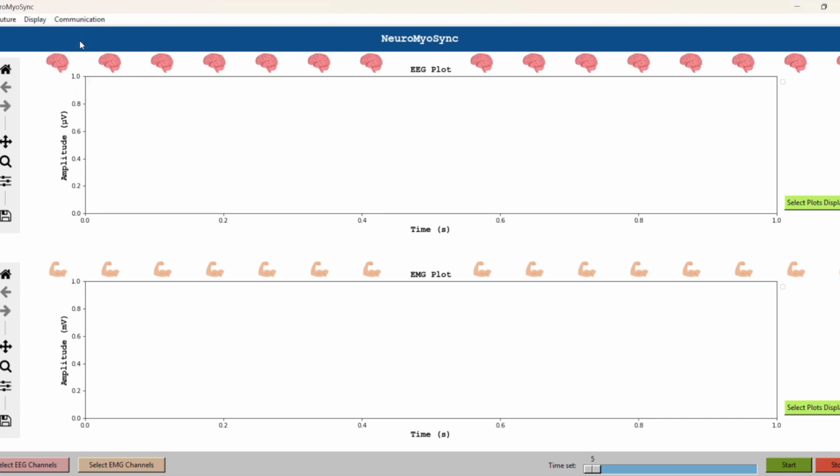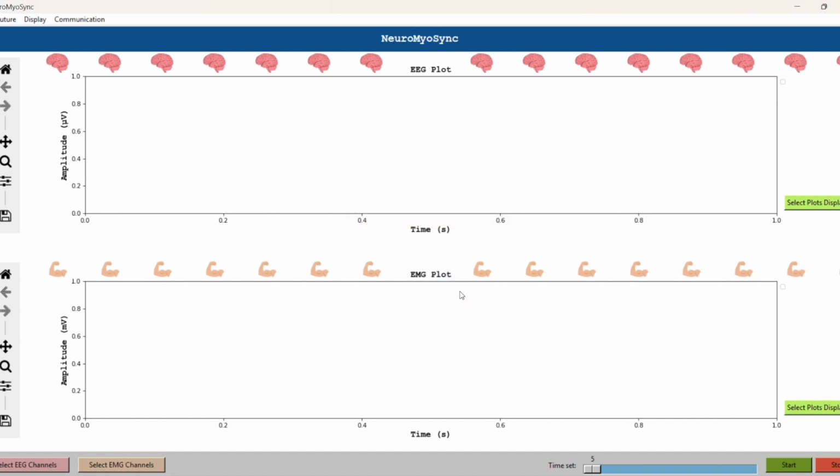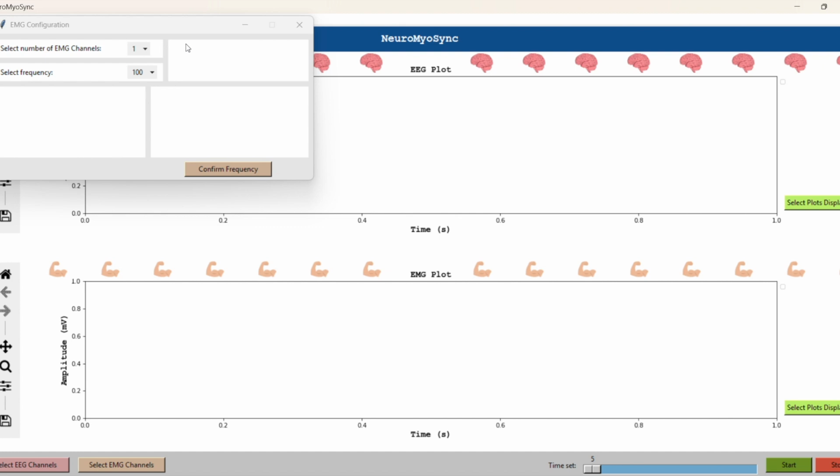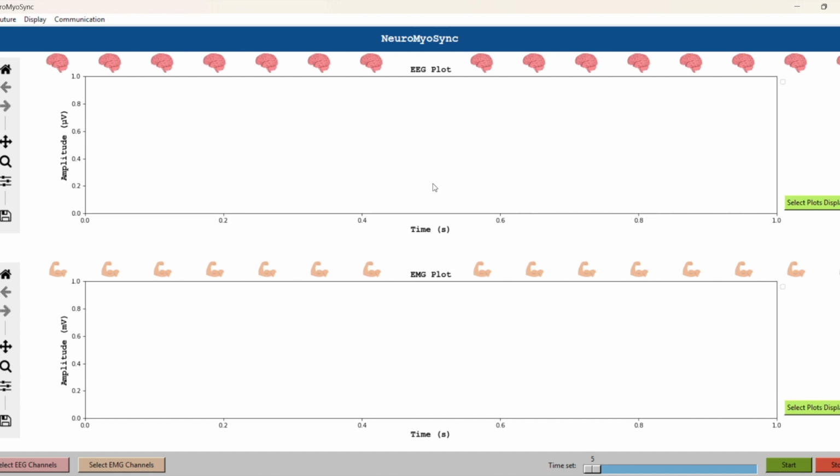If you're ready to begin a trial, you can select communication and connect to whichever device or both. Once it's connected to the device, a pop-up will show which device you're connected to, and you can select OK. For EMG, you will come over here and select your number of channels and the frequency you're looking to use in your trial, and then confirm that. After that, you'll see a pop-up asking if you want to split channels halfway through the trial. If you were to select no, it lets you know you would use channel 1 and 2, and if you select yes, it shows that you will use 4 channels. 1 and 2 will be recorded in the first half of the trial, and then it will switch to 3 and 4 for the second half.